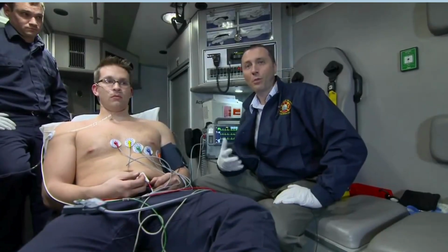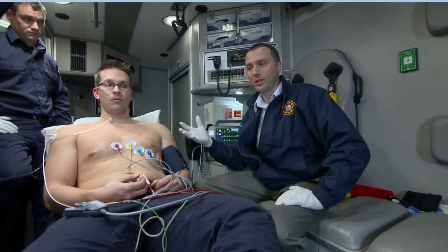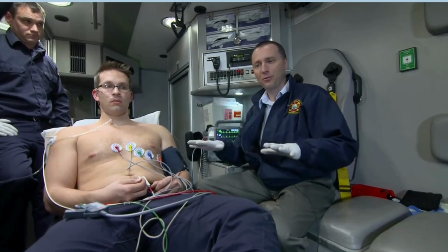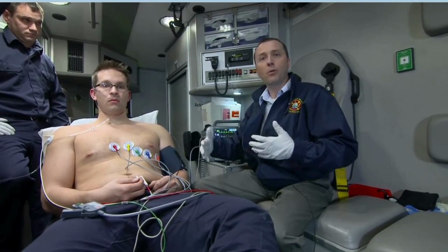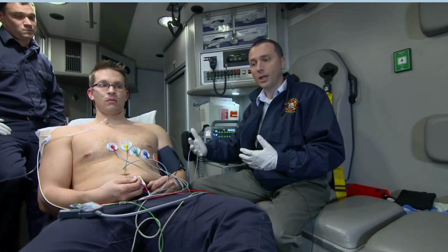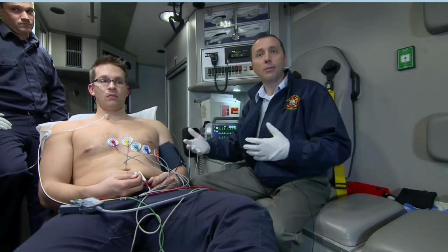One of the most important parts of a successful pre-hospital 12-lead ECG program is capturing a pre-hospital 12-lead ECG with excellent data quality. So here's a couple of tips of the trade just to kind of smooth things out for you. The first thing that I do is make sure that the patient is undressed from the waist up. If it's a female, what I basically do is say, ma'am, we'd like to undress you from the waist up to get a 12-lead ECG. We'll do everything we can to protect your dignity. And so usually, if you frame it like that, they tend to cooperate.